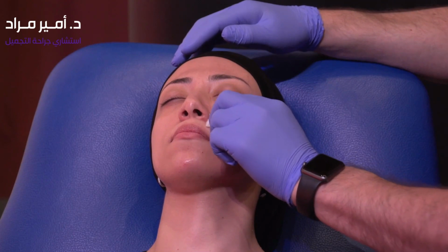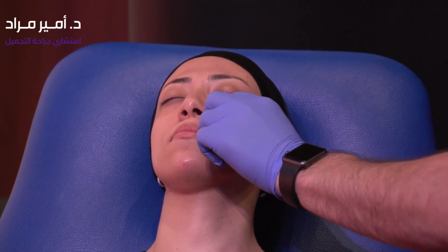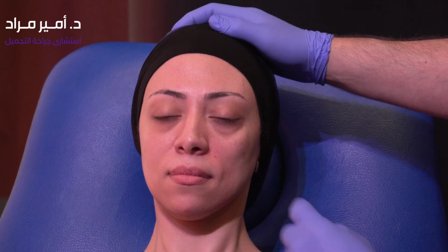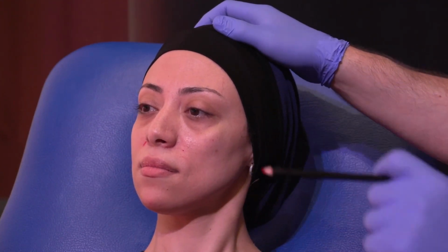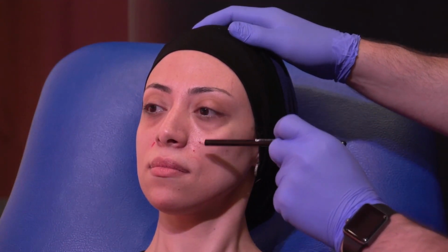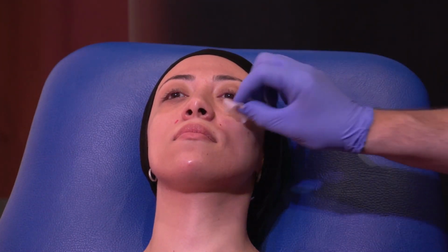So, no massaging. I tell my patient that they might feel a lump in this area. I think it's natural to have a lump in this area just because of the small size of the area that you've injected. If you compare right to left, that line, marking pen, completely gone. And if you have injected this patient down here, you would cause a major disaster to this patient, and you would need to melt it. So this has not only treated her nasolabial fold, but also equalized the fullness that she has. We're camouflaging. A lot of times when you're using fillers, you're camouflaging, okay? So that's the nasolabial fold injection.